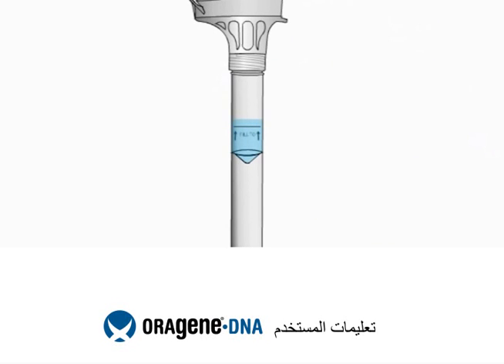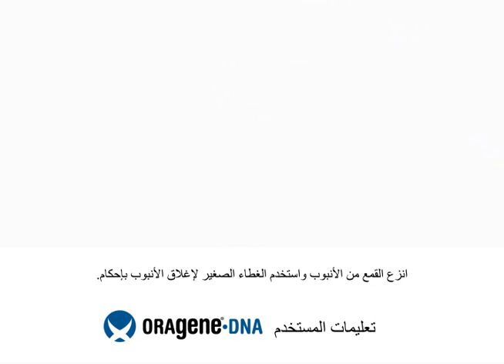You will notice that the solution from the cap will mix with the saliva in the tube. This solution stabilizes and protects your sample until it is analyzed at the lab.